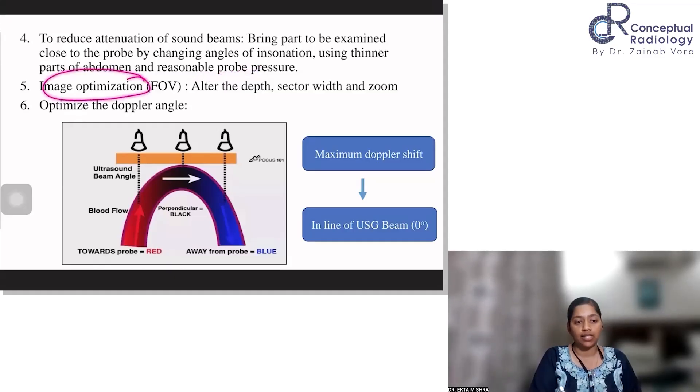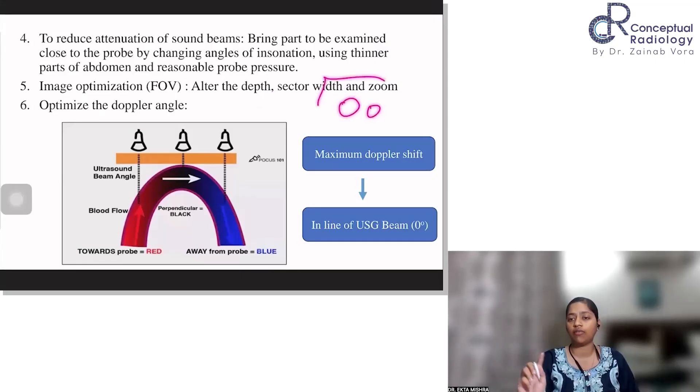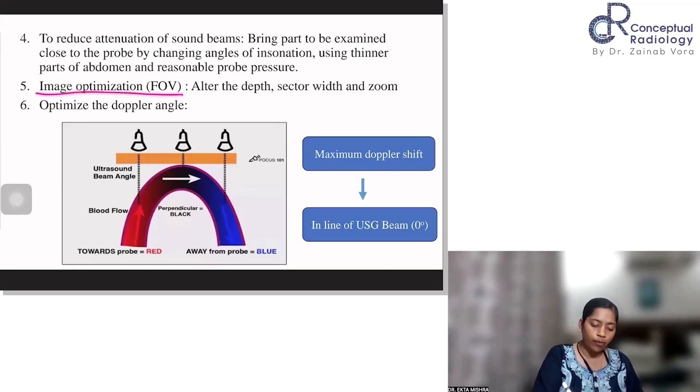After that, image optimization. You can alter the depth because the deeper you go more sound waves get attenuated and your quality decreases. So you alter the depth, the sector width. Don't image everything. You need to focus on the area. You want to focus on the artery. You can reduce the sector width and zoom appropriately. So your frame rate is appropriately adjusted. You want to keep the highest frame rate.